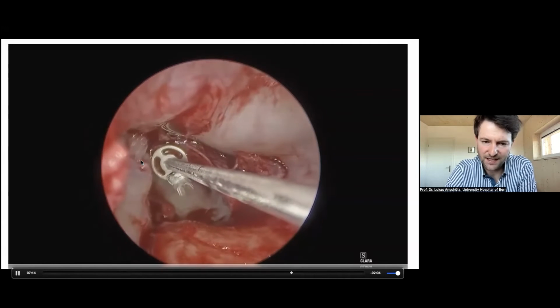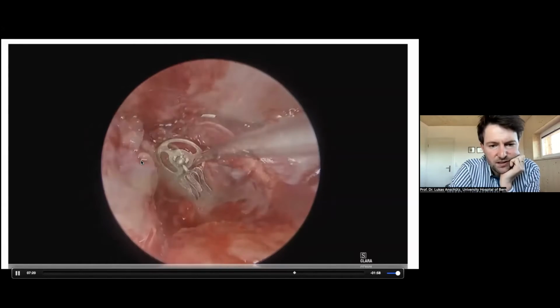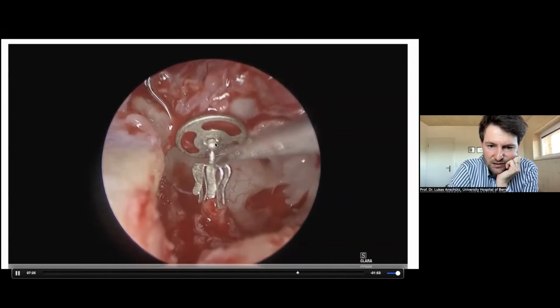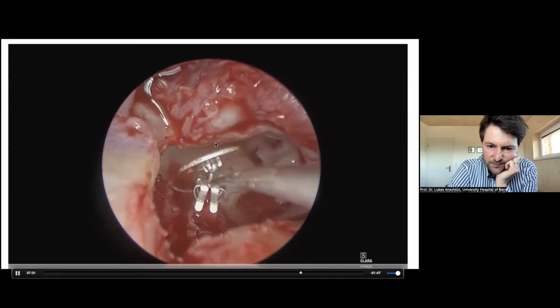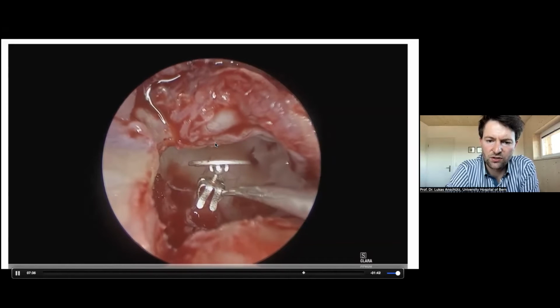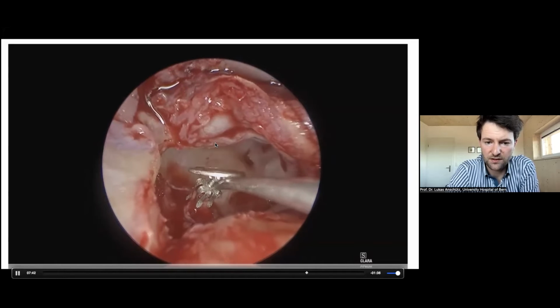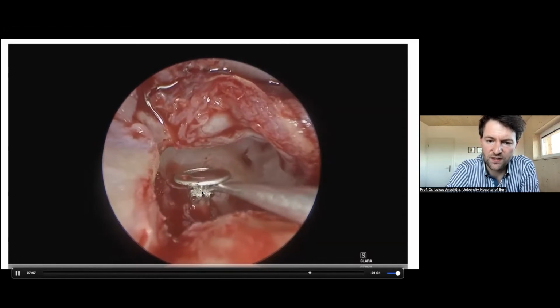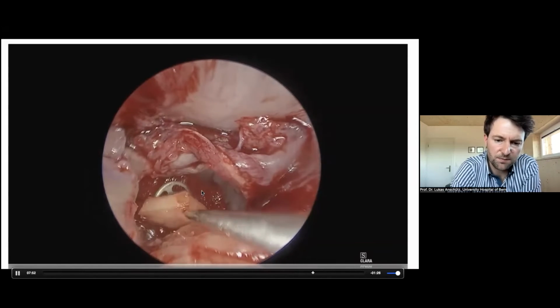And then I show you a second technique for the application of the titanium prosthesis, here with the suction. Then the suction is closed, and you see the prosthesis holds on the hammer, and you can very gently push the prosthesis into its position. You see it's a very straightforward procedure. It's quite fast. It's almost the original sequence. And so you can fix it very gently to the stapes. Be very careful. Don't push on the stapes too much.